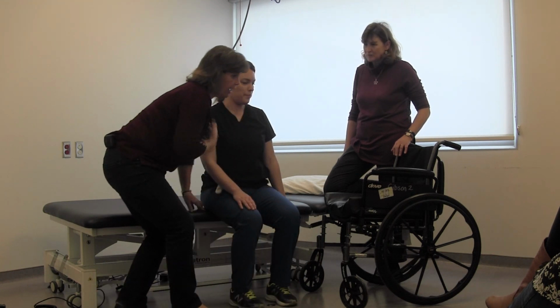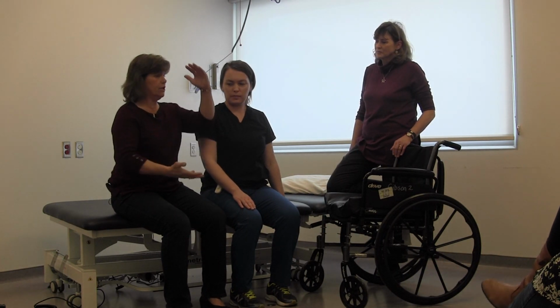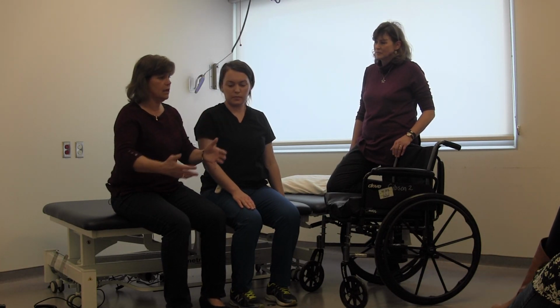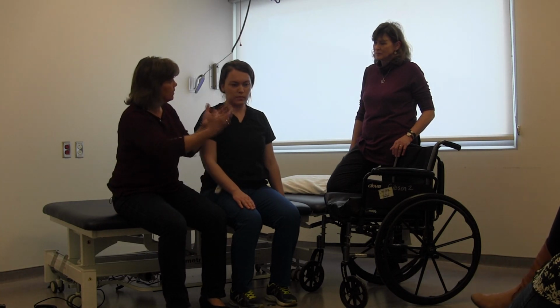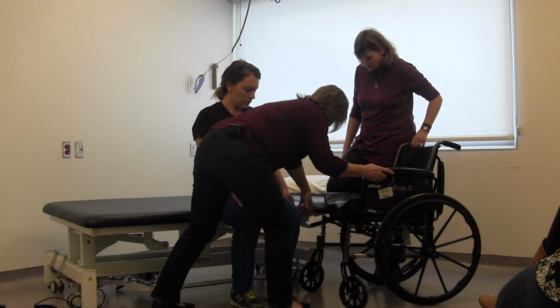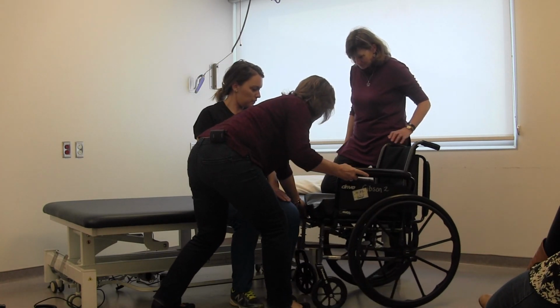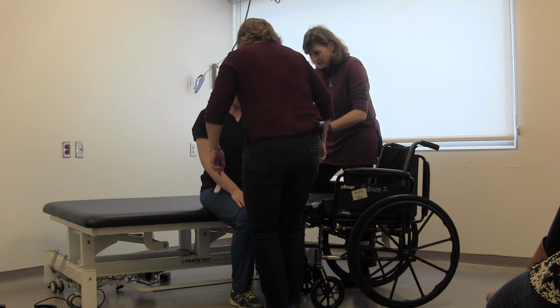Now typically when I have to do a two-person transfer, it's usually on a very big individual. They're very tall and I can't usually get my hands down at the hips. So I think, Barb, what we'll do is I'll get you at the hips and I'll be at the upper trunk. How's that sound? And let's bring this a little bit closer. Let's bring your arm up there. Okay? What side did I say? This is just side. Yeah.